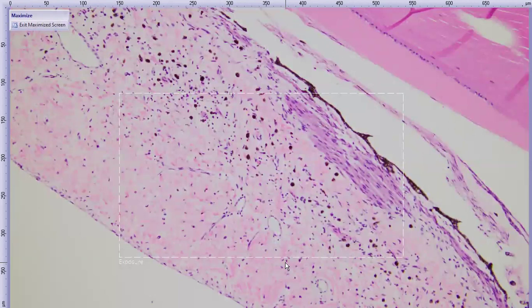So anytime that you have disruption of the iridociliary epithelium, necrosis of the uvea, anything that might release melanin into the eye, you could get macrophages coming in and phagocytosing that. So melanin-laden macrophages are not specific for uveodermatologic syndrome, not diagnostic for it. And if you had this case completely out of context, no signalment, no history, it would be very difficult to make a specific diagnosis with just this.